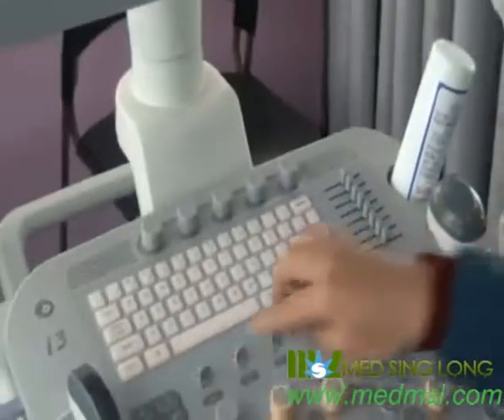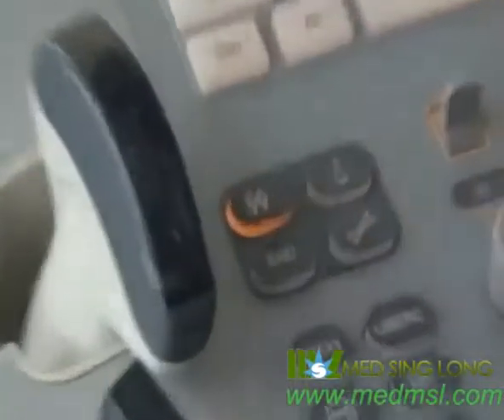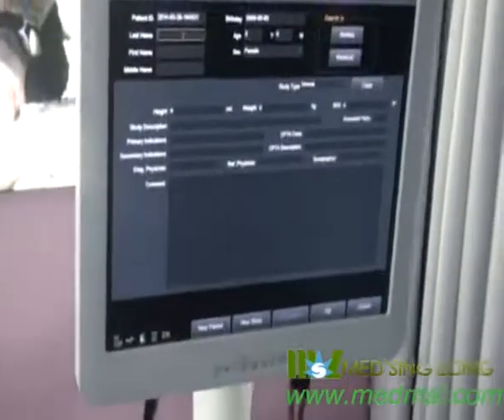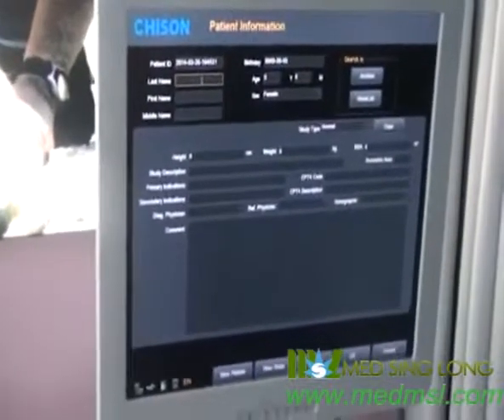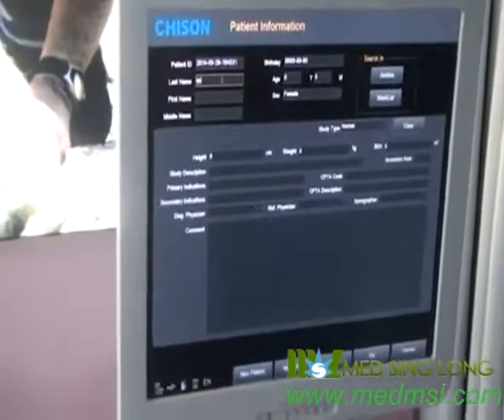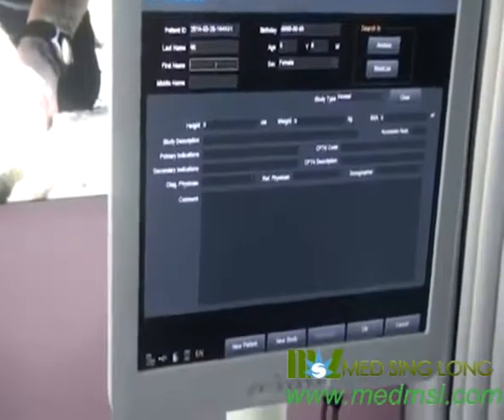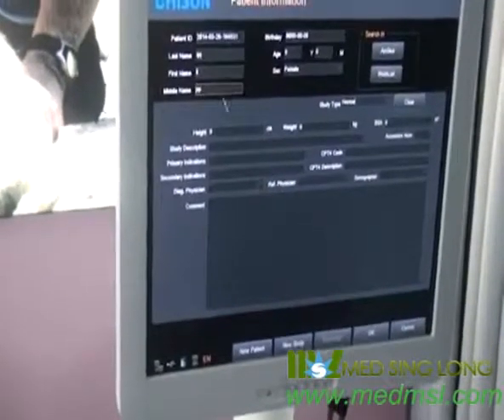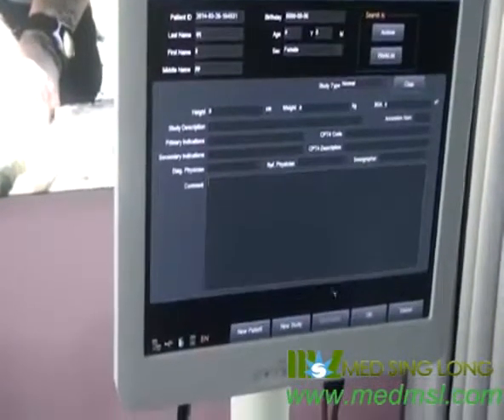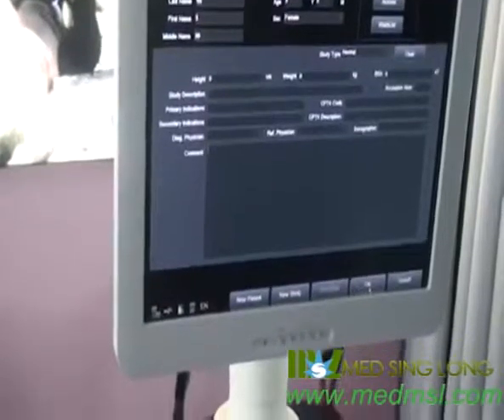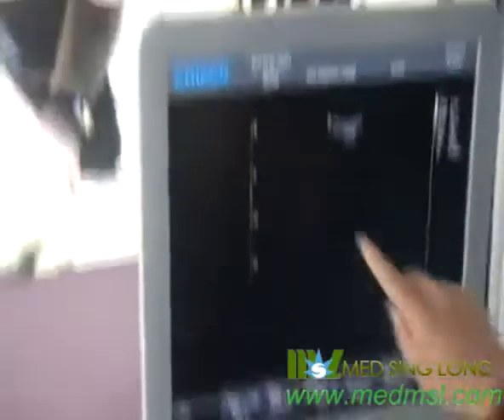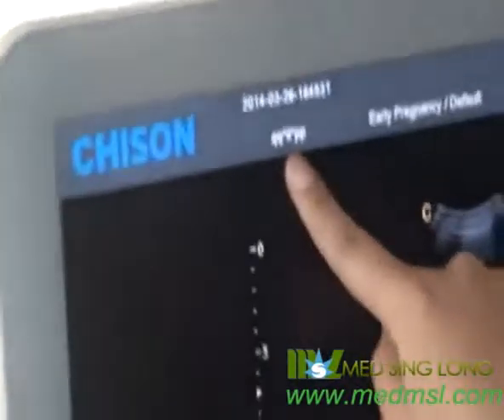First, press the patient key to create a new patient record. Input the information as needed: last name, first name, and middle name. Move the trackball and press the Enter key to create a new patient. Here you can see the patient information.